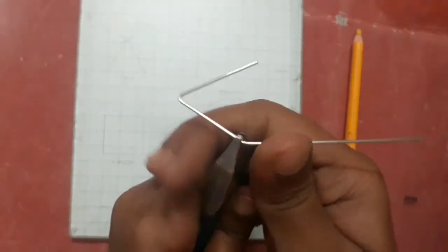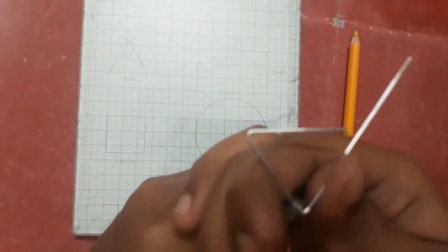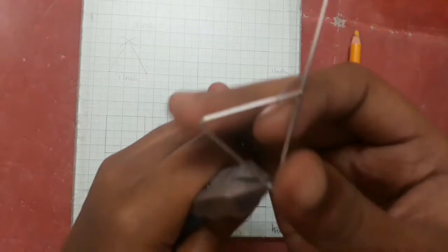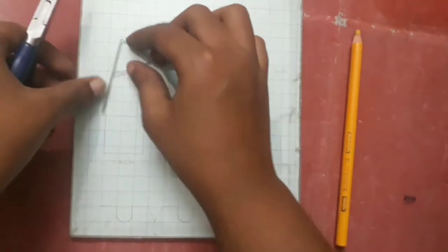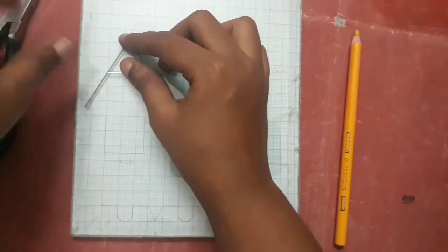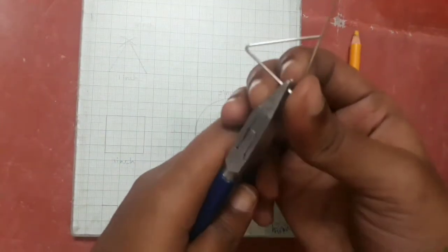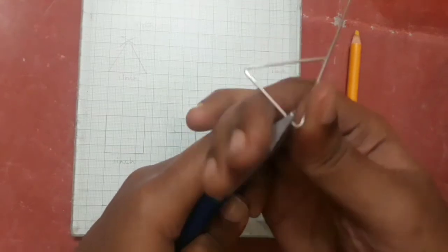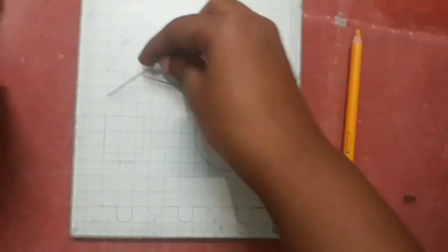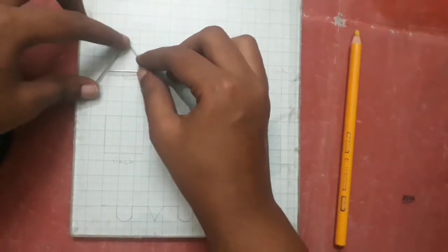If you want to bend like this, you can bend like this. Okay, let's bend like this. We can do slight adjustments. The triangular end is closed — we can bend like this.